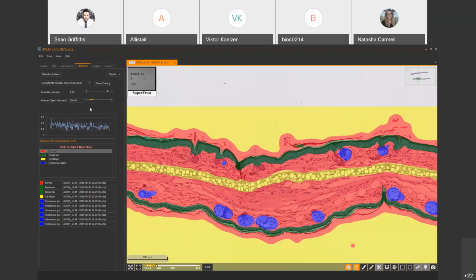Because in the past, using simpler things rather than the AI one, I think it was Random Forest I was trying to use at one point, I basically just had 3 different classes. One was well differentiated, one was poorly differentiated, for example. Does the AI handle variation in appearance across the same entity? It should do.